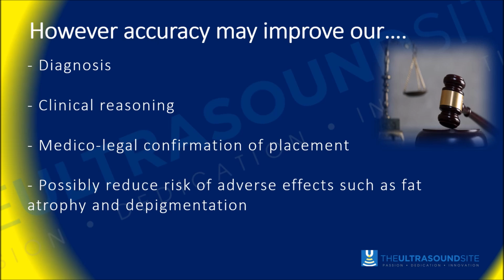And there is possibly the opportunity to reduce the risk of adverse effects such as depigmentation, atrophy and needle trauma, by being able to accurately place the needle within the relevant layer of the target tissue.